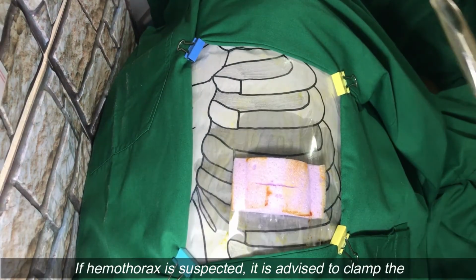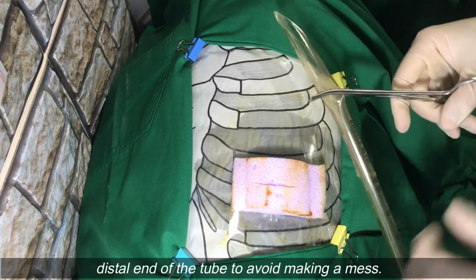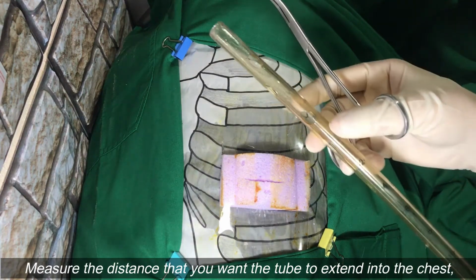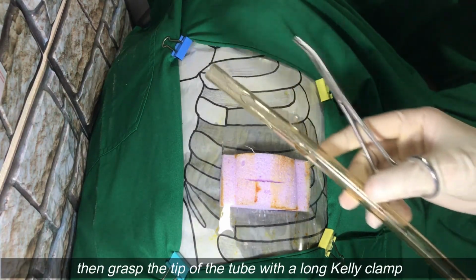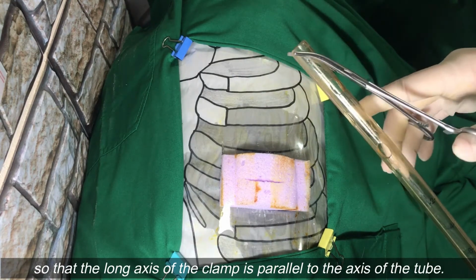If hemothorax is suspected, it is advised to clamp the distal end of the tube to avoid making a mess. Measure the distance that you want the tube to extend into the chest. Then grasp the tip of the tube with a long Kelly clamp so that the long axis of the clamp is parallel to the axis of the tube.